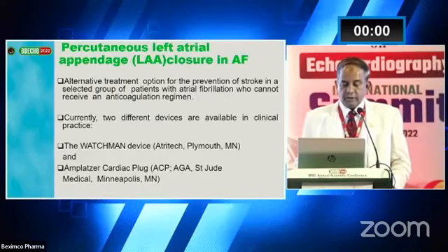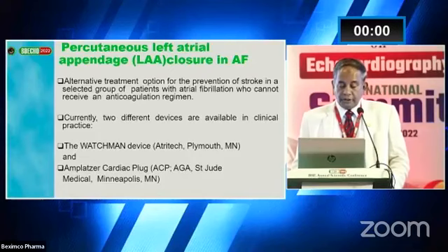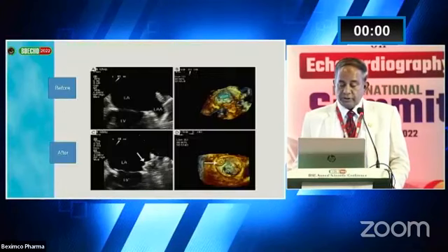Another situation where echo is used is in left atrial appendage closure. This also plays an important role.